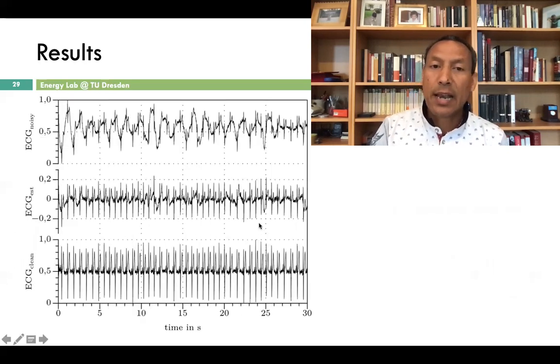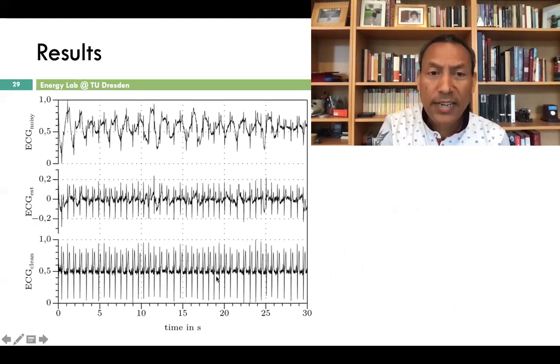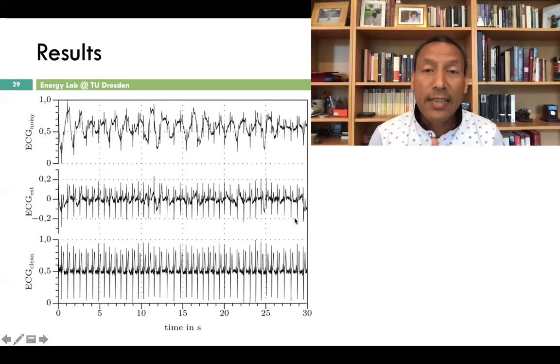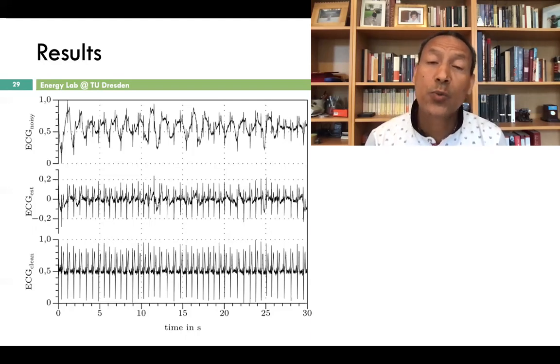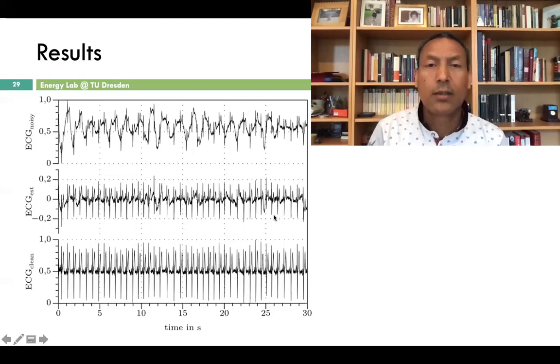So with tensor decomposition, it's possible to dissociate them. Likewise, here you can see now, this was the original clean signal, this was the corrupted signal, and now this is what we approximated. At least as regards the QRS complex, the wave complex which is associated with the ventricular activities, can be detected here cleanly.